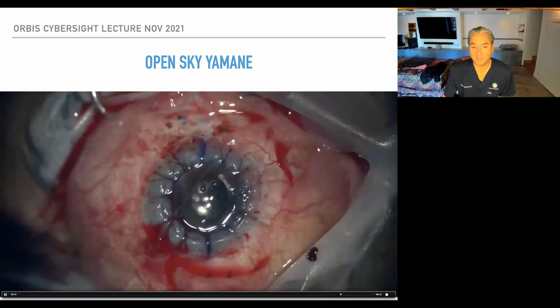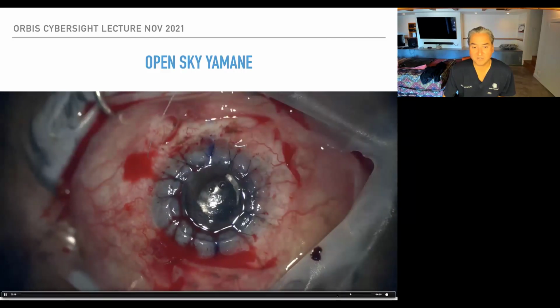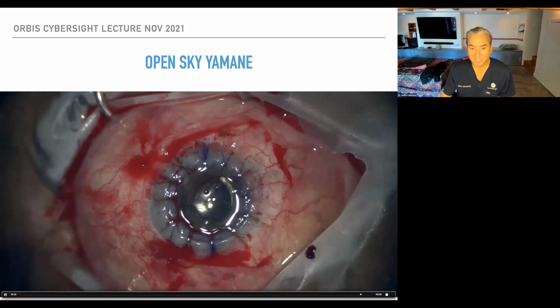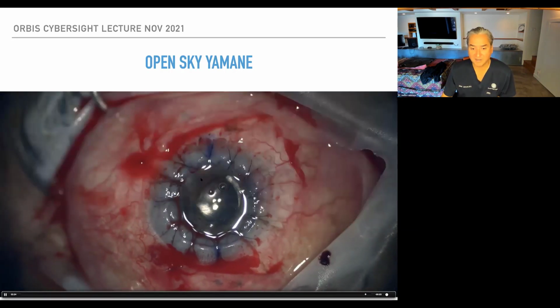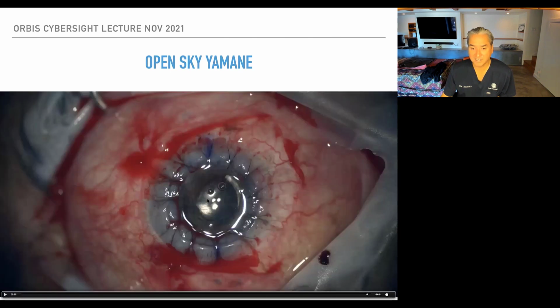And now a running suture, now closing the conj, and then you'll kind of see here at the end what the suture looks like. You can see this case again on my web, on my YouTube page. But anyway, you can see at the end of the case there that we got a nice lens. We'll go back right there. You can see a nice lens there. I did a little iris work that I edited out, but basically cornea in place, and you can see kind of under the conj here, there's that little bulb of a haptic. And so patients do real well with this technique.